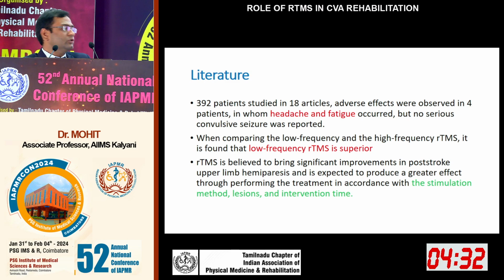As per literature support, apart from the major seizure side effect, some patients experience headache and fatigue, but no serious convulsive seizures are reported. It is found that low frequency rTMS is superior to high frequency, and the main thing is that the effect mainly depends upon the site of stimulation, the method, lesions, and intervention time.